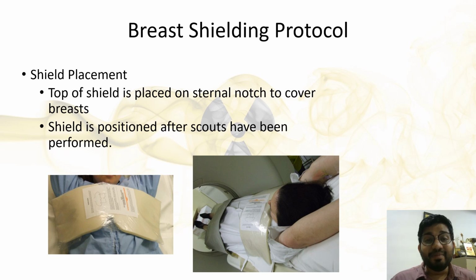As I mentioned, we are keeping above the isocenter and below the isocenter. Similarly, if we are keeping a bismuth shield, even though it is bismuth, there is some attenuation, isn't it? That is why we are using it as a shield. So if you keep it on during the topogram, what will happen? Because of that attenuation, the automatic tube current modulation will fail, as the modulation does not incorporate the shield into its mA calculation. That's why you avoid shielding before the topogram. Once you have positioned the patient and the topogram is done, then you can keep the shield for the helical scan.